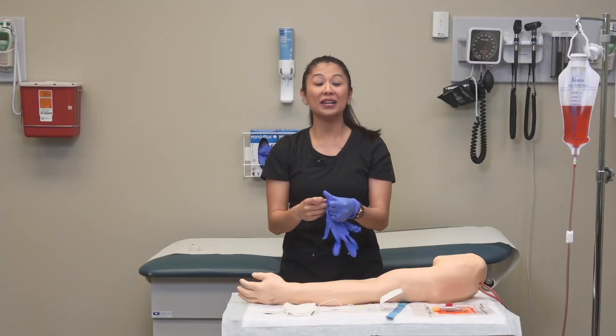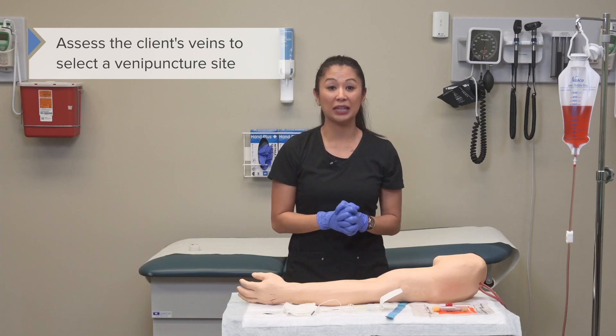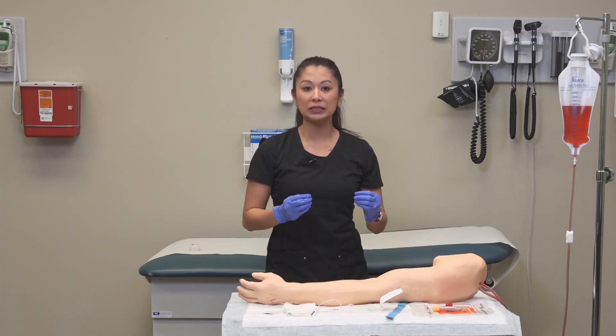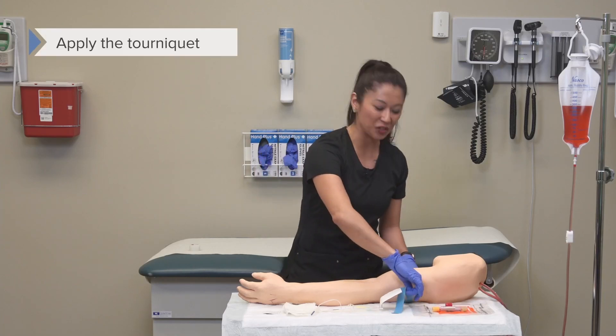When we don our gloves, it's important to assess the client's veins to select which venipuncture site we'd like to use. It's very common to perform venipuncture at what we call the antecubital or AC site. Now we can go ahead and apply our tourniquet.